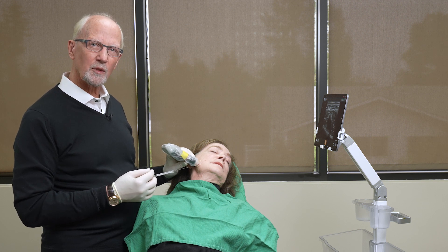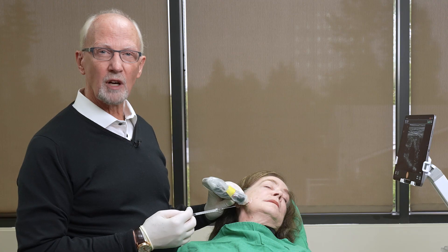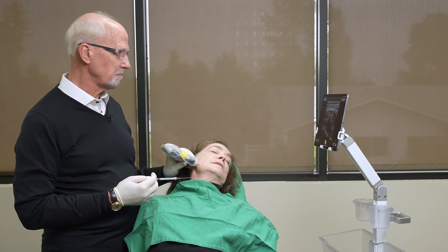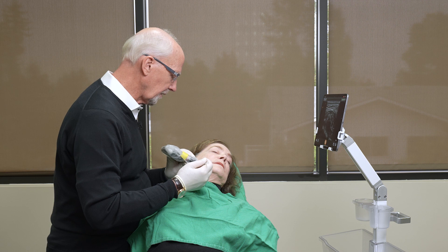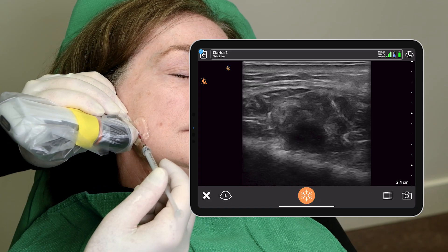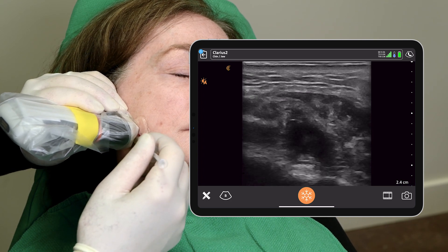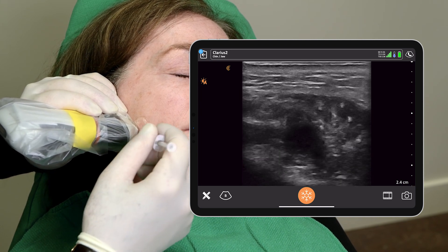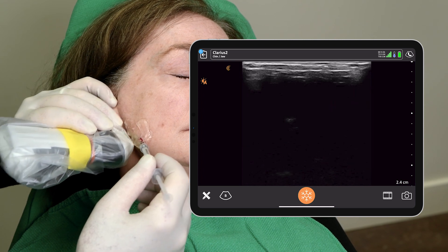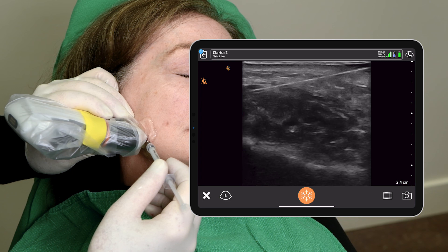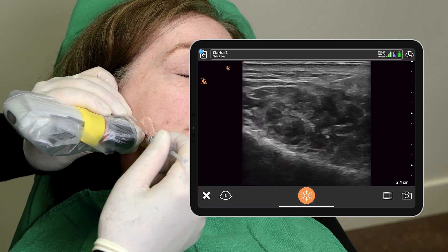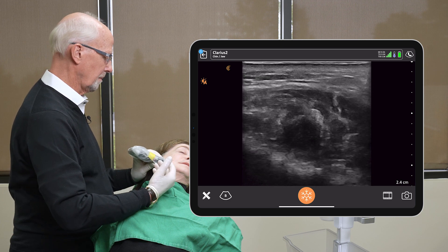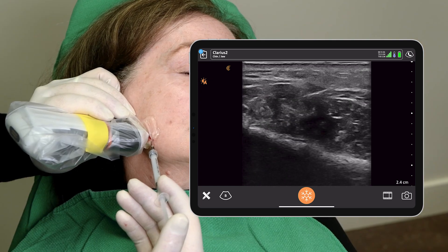What I'm now going to do is inject this directly with some triamcinolone acetonide, 20 milligrams per mil, right into the body of the nodule, and we'll see how that then changes the course of this lesion. We're using a much thinner needle. We're in our nodule and you can just see the steroid go in.